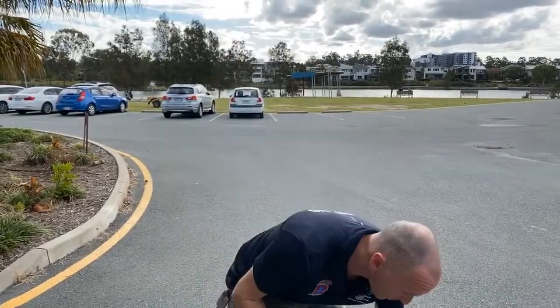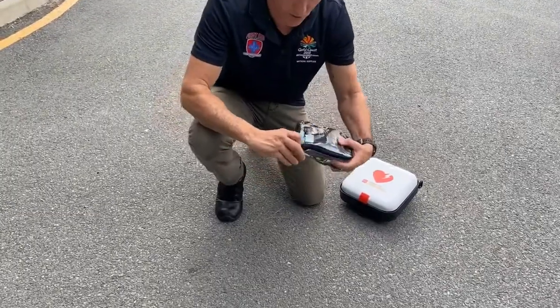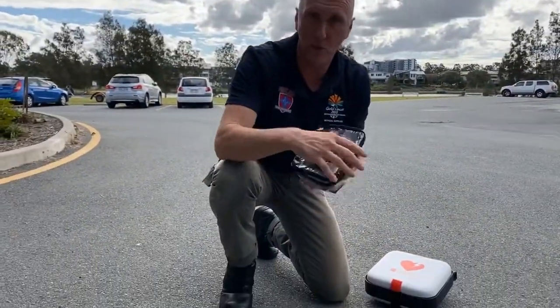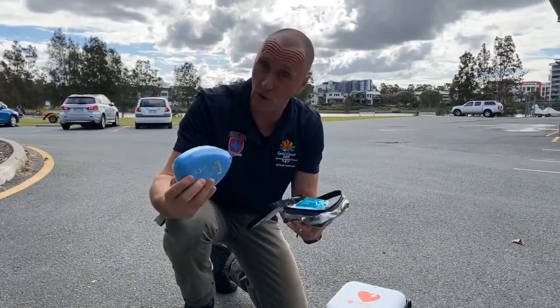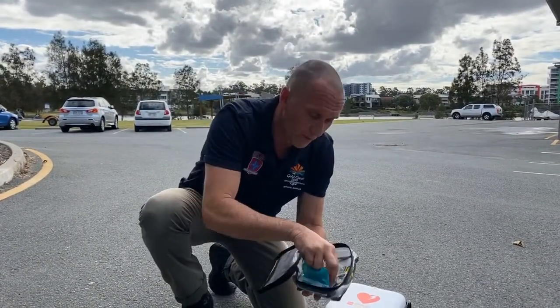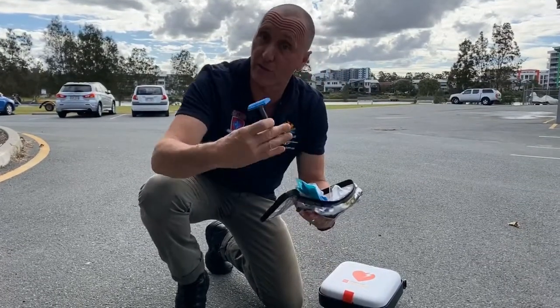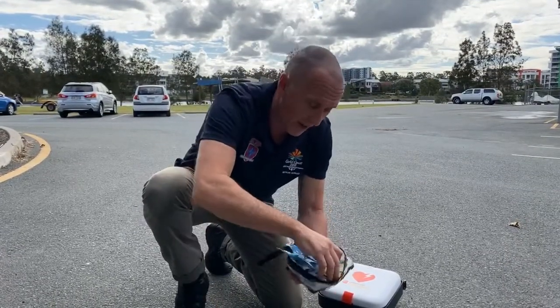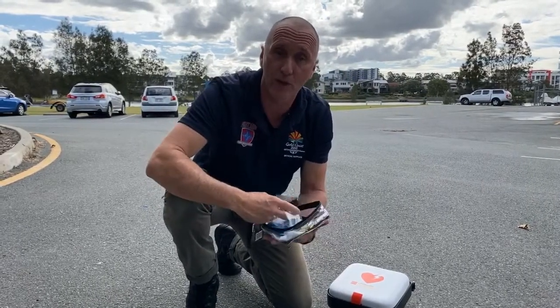You need to grab your CR2 defibrillator and your patient prep pack out of here and take it to the patient. Once you've retrieved your CR2 defibrillator and your patient prep pack, it's important to remember that in this patient prep pack we have a few important things to use on the patient being resuscitated. We have a CPR face shield if you decide to give breaths and compressions, a surgical razor to remove hair from your patient so the defibrillator works effectively, and a pair of medical shears to remove the clothing from your patient.